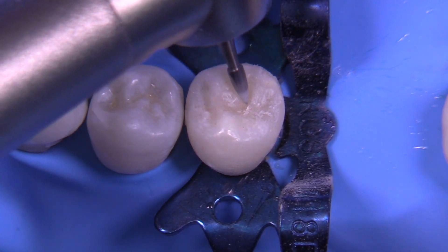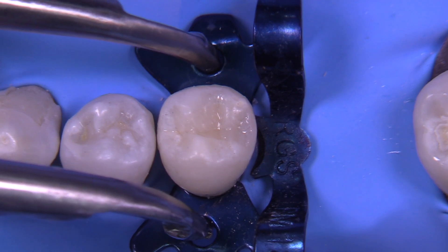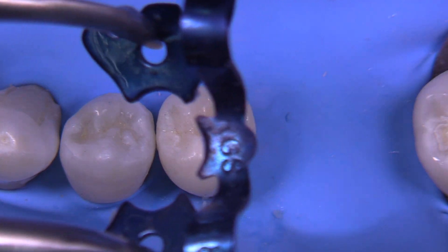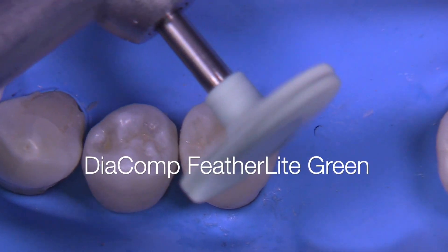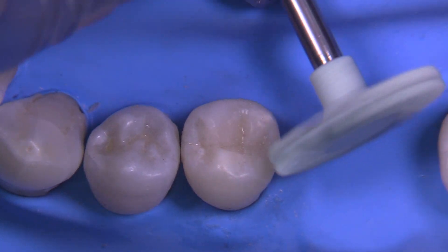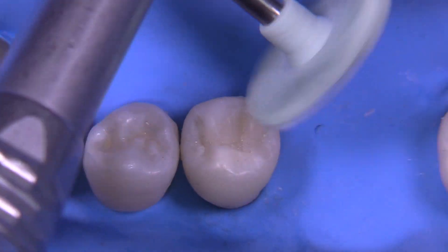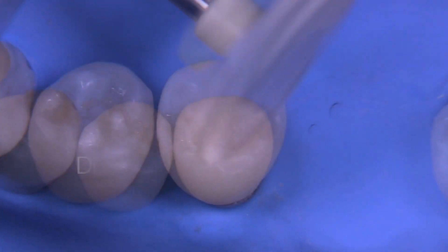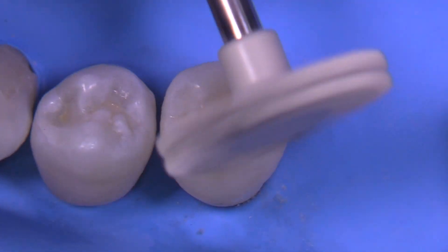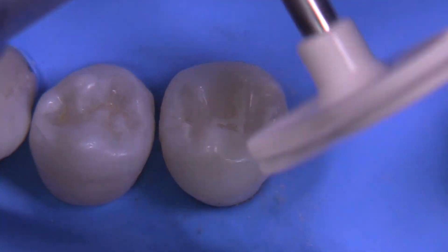With that little Stevenson set, you have very little anatomy to redo, which is really cool. Let's go ahead and remove the PM18 RGS instrument — a titanium nitride coated clamp — and then use the Diacomp Feather Light green, followed by the Diacomp Feather Light gray. I'll occasionally use the Cosmedent cups and points on the occlusal, but in this particular case it wasn't absolutely necessary, though for a larger composite it would be advisable. Lots of air spray, water spray — keep them cool — and a light touch.